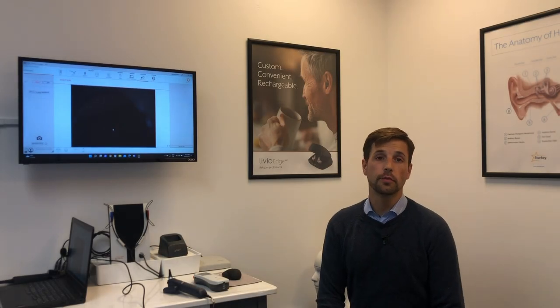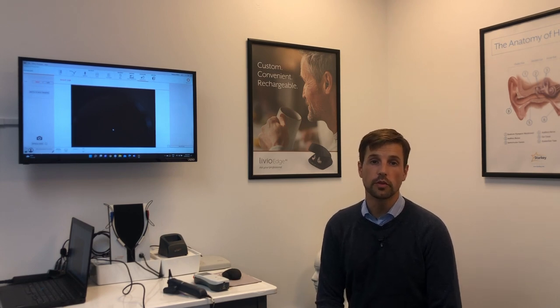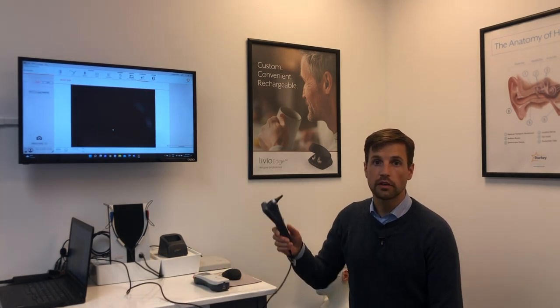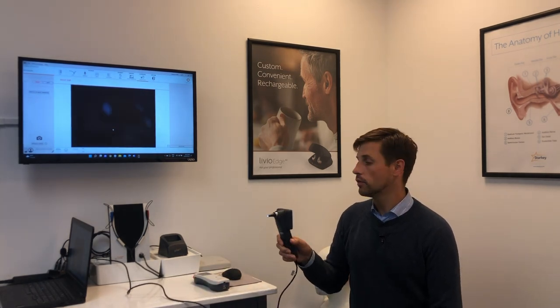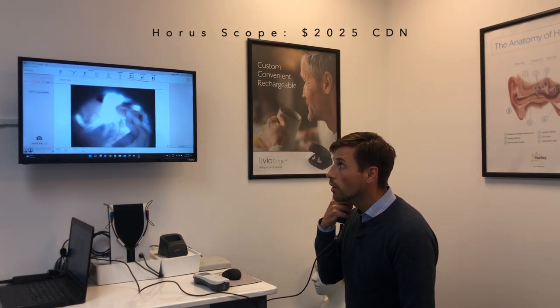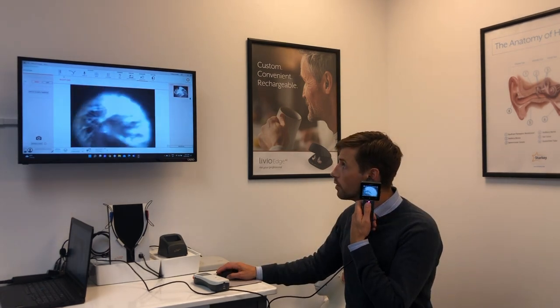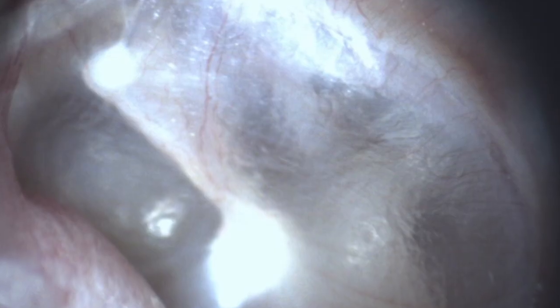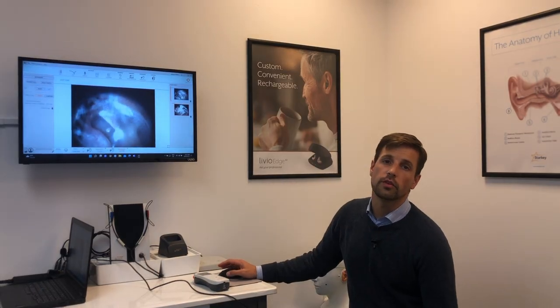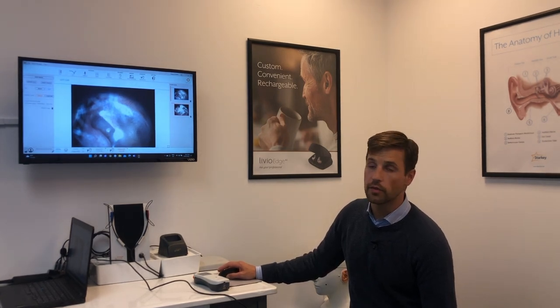Nowadays it's really important to have a video otoscope in your office to show patients what you're seeing while you're seeing it. The otoscope connected to Maestro, the Inventus software, is a great way to do that. I'll just have a look at my own ear here, snap a photo, same thing on the left. In this way the patient can really see what you're seeing, and of course we save that and have it on the patient's file.